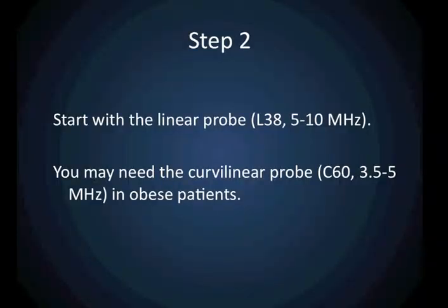Start with the linear probe, or the L38. You may find that in a more obese patient you'll have to move to the curvilinear probe if you can't see what you need to see.